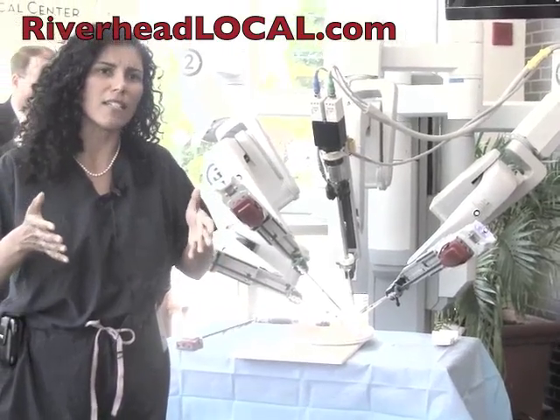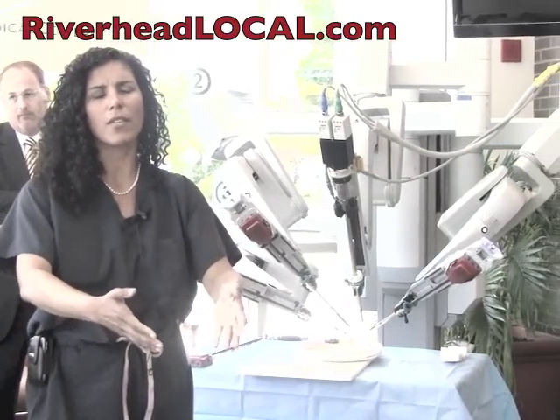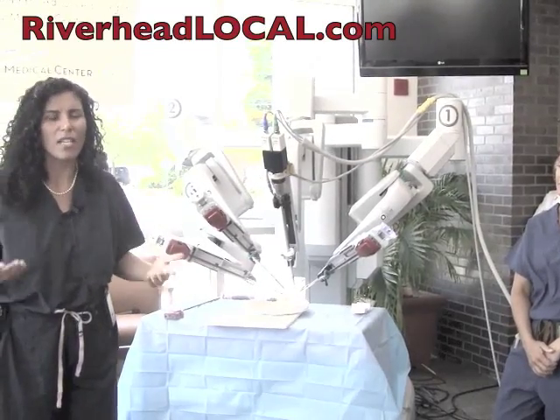The only difference is that the 3D image that you see live is much closer to the target anatomy. So whereas if you're operating an arm's length away, you may not see a tiny blood vessel, here you see every single blood vessel, and the result is much less blood loss. If I may talk about Denise one more time, if we lost a tablespoon of blood with Denise's surgery, it was a lot. And that was because I could identify every single vessel and cauterize every single vessel. So it's a lot more elegant, it's a lot more refined, it's a lot cleaner, visibility is a lot better, and then the end result is an outstanding patient outcome.